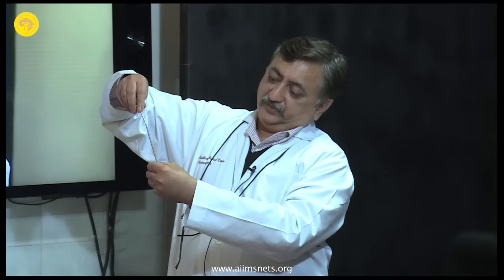Do you see this obliquity, the oblique sloping nature of the S1? If you don't angle to this point, your screw will come out somewhere here and your length of the screw will be smaller. And the smaller the screw, the easier for it to pull out. So you must aim at the promontory. This is called the sacral promontory. Your screw should be angled to the middle of the sacral promontory. So your mediality has to be this much. It's here and your starting point is here. Do you see that? It's almost 25 degrees, sometimes even up to 30 degrees depending upon how the pelvis is shaped.